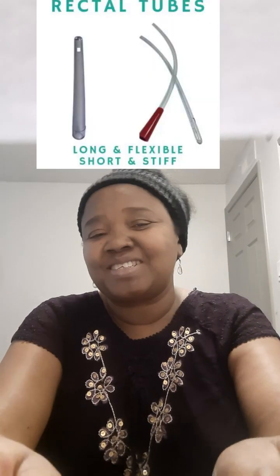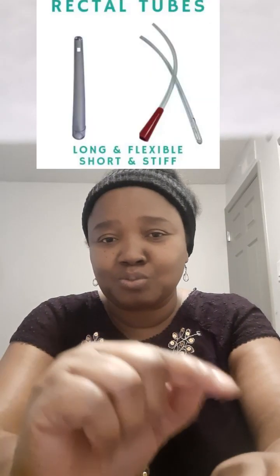Now let's move on to the more invasive ones. Another one is the rectal tube. The rectal tube is just like you see in the image. A tube, just like a urethral catheter. You just put it in, and then the rectum is emptied, and then you remove it. It's just like using an intermittent catheter for urine. So it's similar. There are flexible ones.